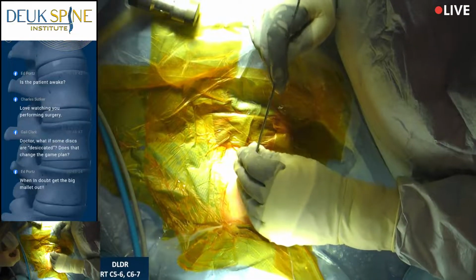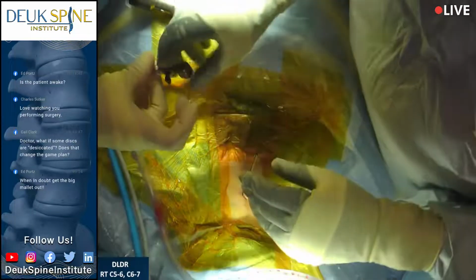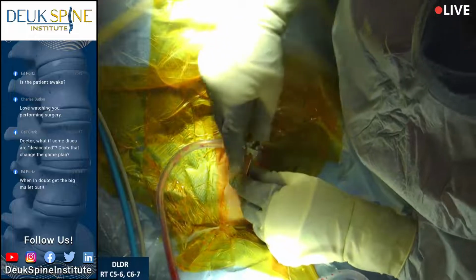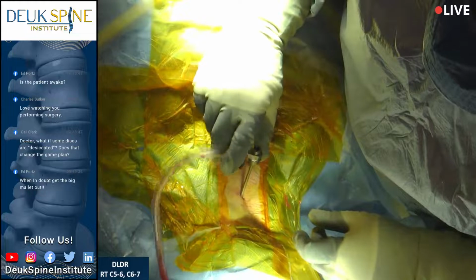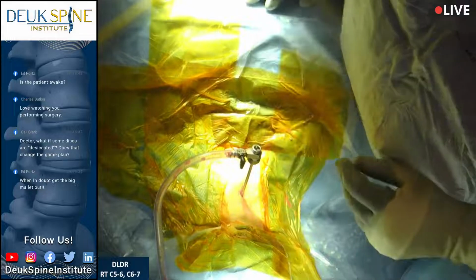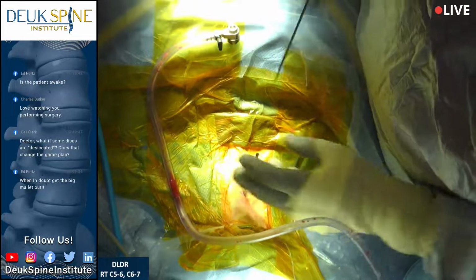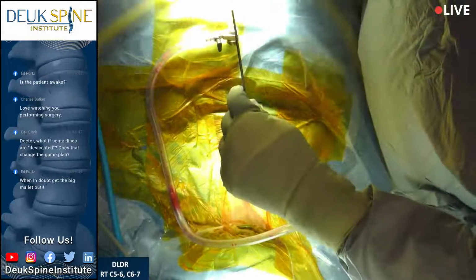All right, welcome back. We are just fitting the tube to the adapter, and because her discs are so collapsed, we're having to put a little more force onto the tool that actually pushes against the tube. And what that's doing is basically bending these little ends. Let's have that dilator again. And then every time I put the adapter on, it bends it back in.